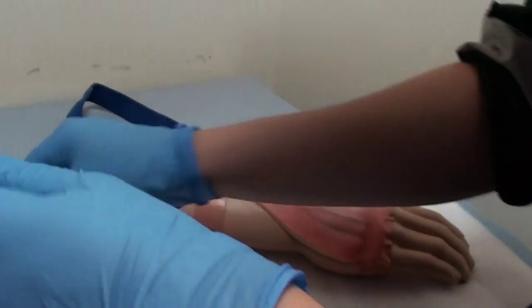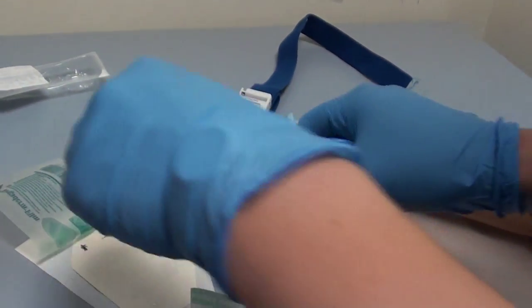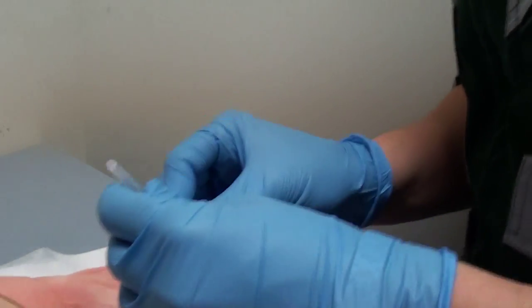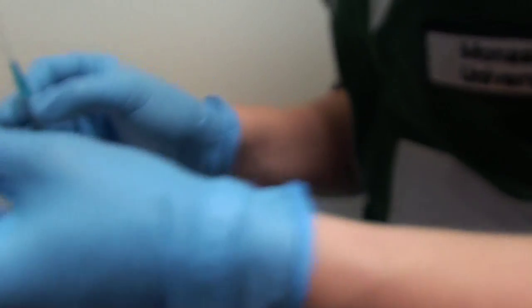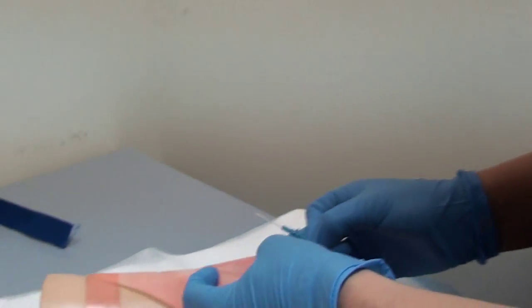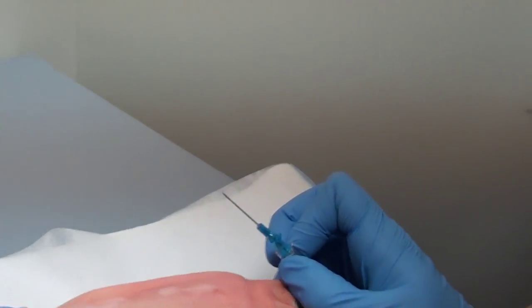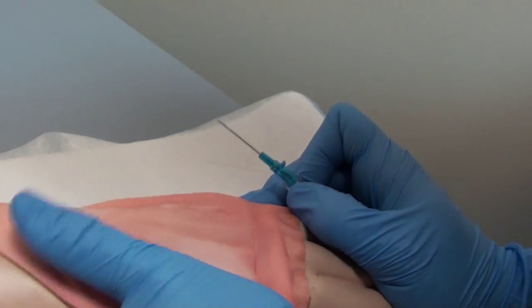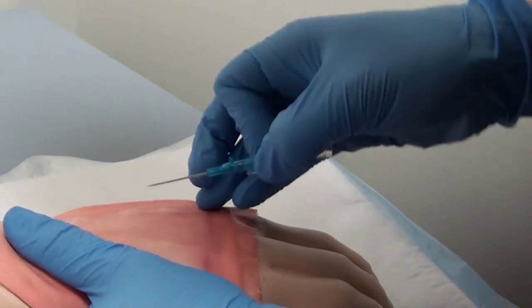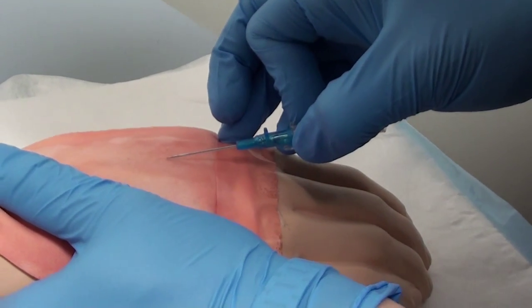And while I'm doing that, I'll get my cannula out. Just ensure I've got everything ready to go. Just putting this on a slight angle. Just pulling this patient's skin taut across so I can get a good entrance to the vein. It's a good one because there's no bifurcations.